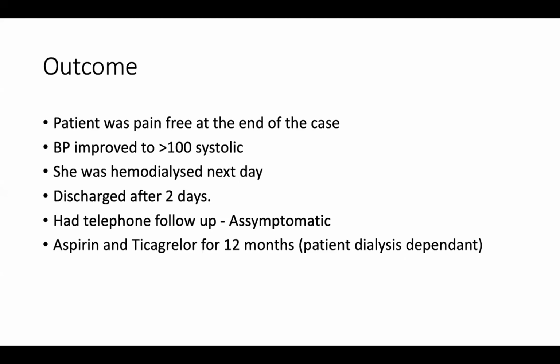Sohail, would you agree with that? I clicked not needed actually. So did I. So the point, I guess, we have some data from the IABP-SHOCK trials, and IABP now is a class 3 indication. Yes, it can be even dangerous.